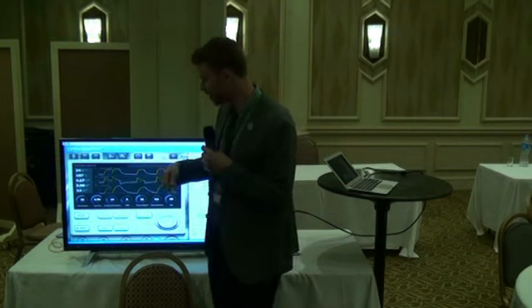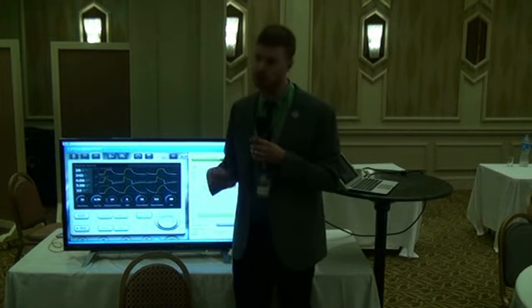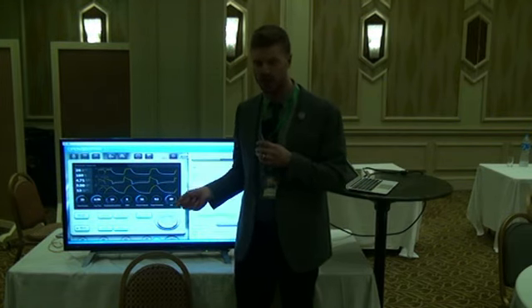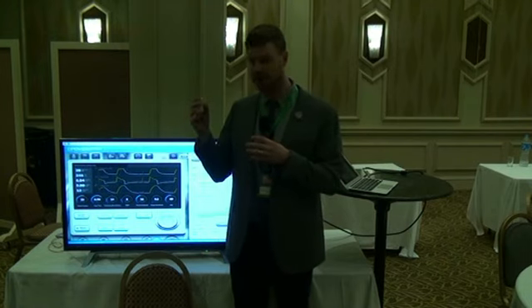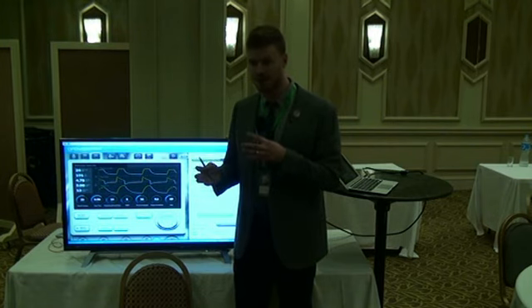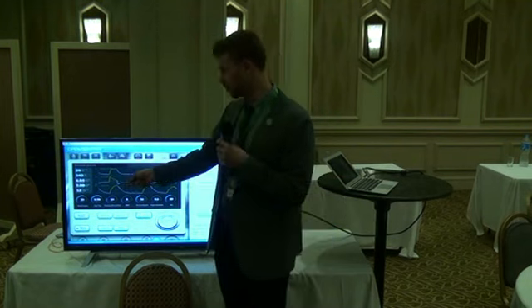All right, so time constants. Usually I ask people, and a lot of people don't necessarily think about it, aren't as quick to apply the equation and understand the physiologic ramifications. But my answer, if nobody knew what it was off the top of their head, is I would say everybody thinks about time constants, but you never just do the math. And the way we think about it is interpreting the flow graphic, right?